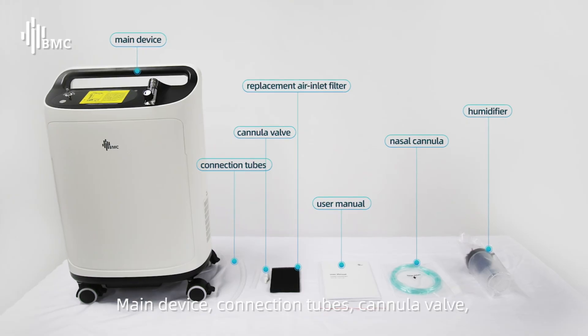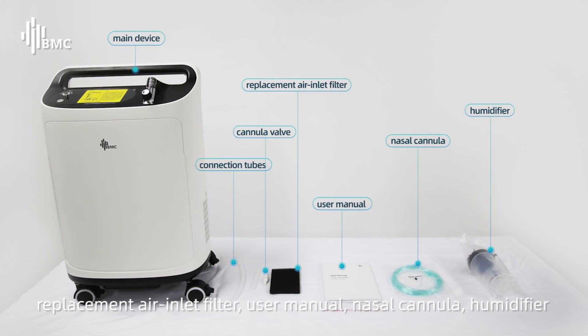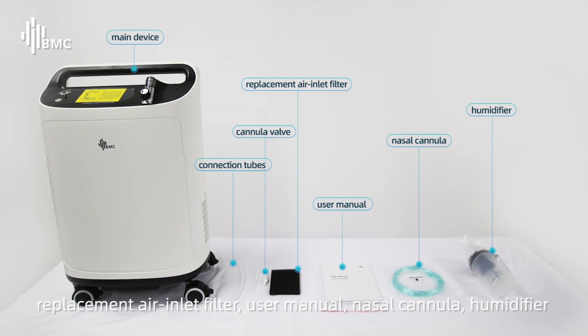Main device, connection tubes, cannula valve, replacement air inlet filter, user manual, nasal cannula, humidifier.